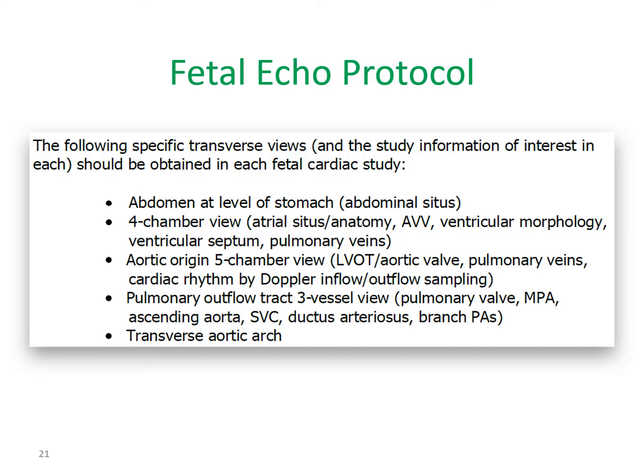We then sweep up to the aortic and ductal arches, make sure that they arch to the left and form a V, left of the trachea, and we follow that up with color and spectral Doppler as well.